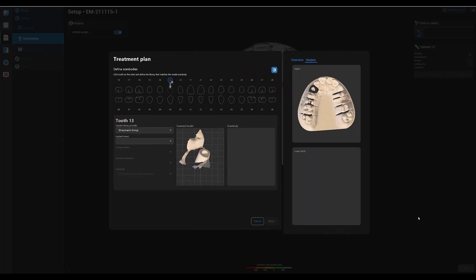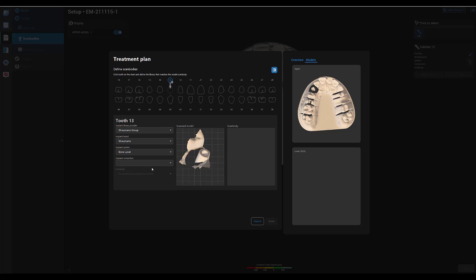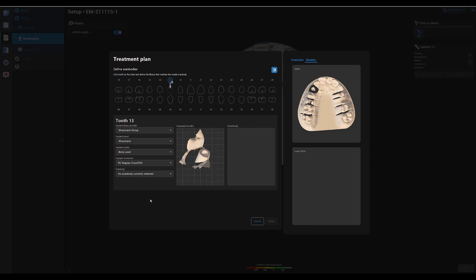Now we select the scan body. First of all, we select the implant library provider, followed by the implant brand, then the implant system. Now we select the correct platform. As a last step, we select the correct scan body.